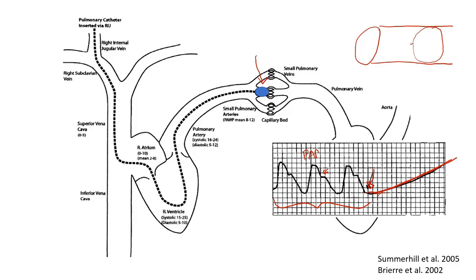It's wedged, and then we get our measurements at the distal tip here. Well, let's say we advanced it further down, into a much smaller arteriole at this point. Now, if we inflate that same balloon in this little artery, what's going to happen is it can't expand to that nice sphere.